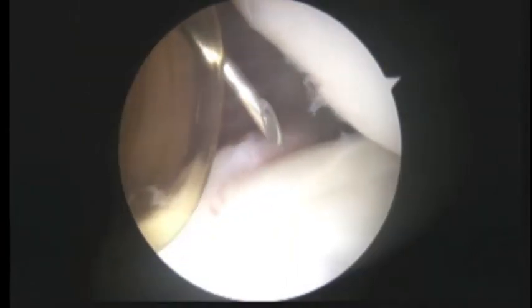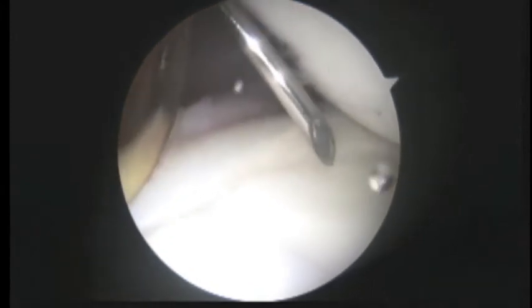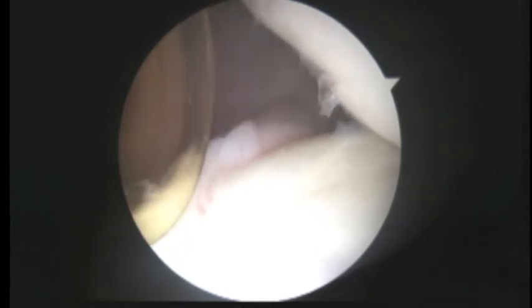Okay, so here we are using a spinal needle. We're looking towards the back now. We're going to place a suture anchor into the glenoid right about here. We'll make a little nick in the skin. This is basically what we call a percutaneous insertion, meaning we don't make a separate incision.